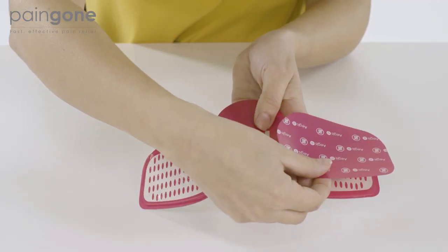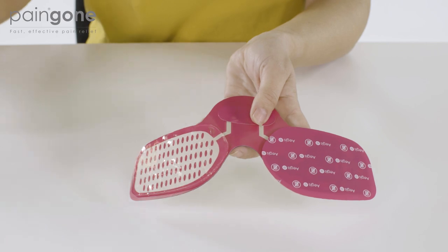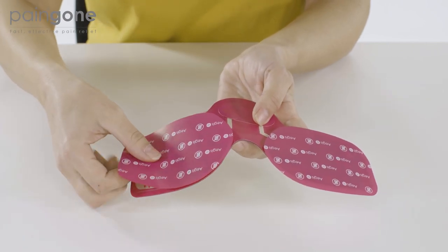When you are ready to stop using Aegis, place the plastic covers you have retained over the gel pads to protect them while the device is not in use.